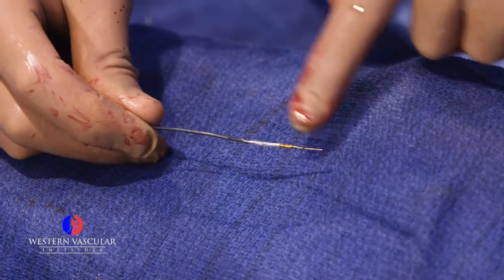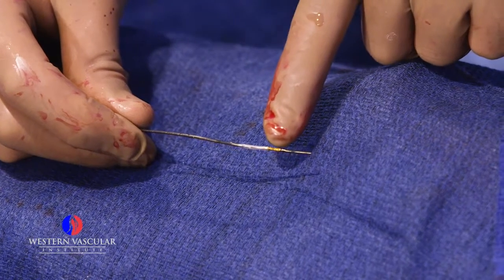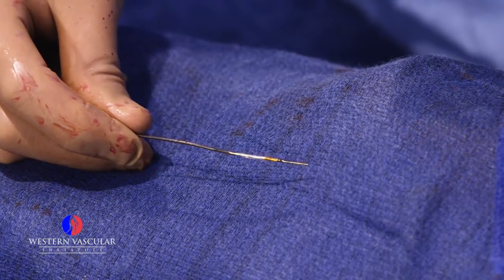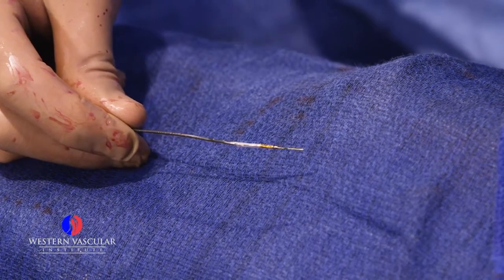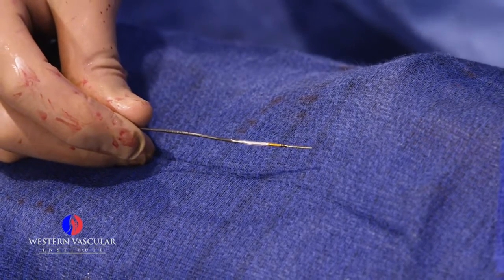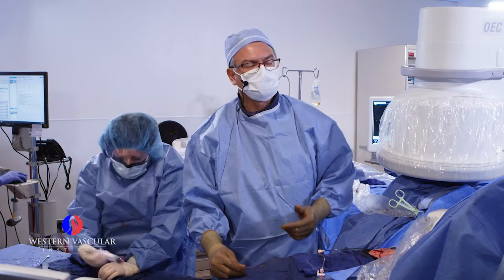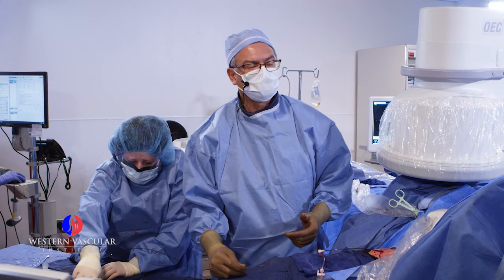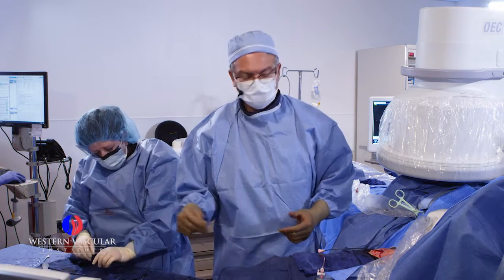It's a very tapered, very small device. Right in this area that is almost like a yellow color, there's a transducer. It's a technology that spins around and recreates circumferentially the anatomy of the vessel that you want to interrogate, or the vessel that you want to see. It gives you such detail that you can identify plaque versus thrombus, and also gives you the dimensions of the artery. We can measure how big the artery is, how long the blockage is, and it gives you the characteristics of the problem that you're looking at.